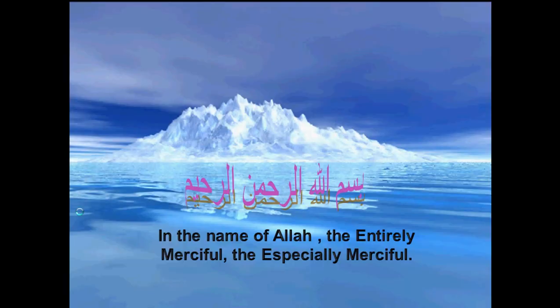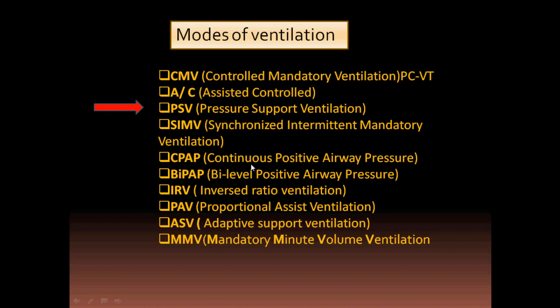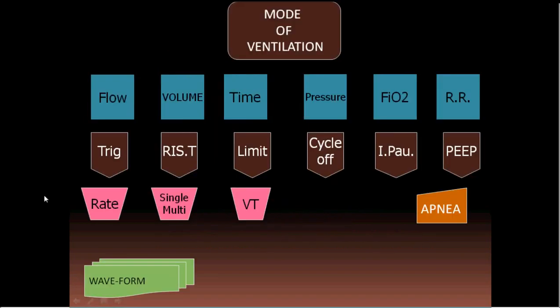Bismillahirrahmanirrahim. Today we are going to talk about another important mode of ventilation, which is pressure support ventilation. This is a very nice mode, which is what we call a spontaneous mode of ventilation. The patient starts and the patient terminates the cycle in a respiratory cycle.